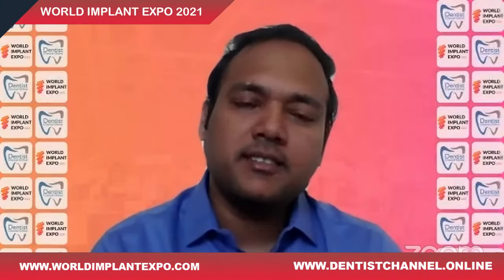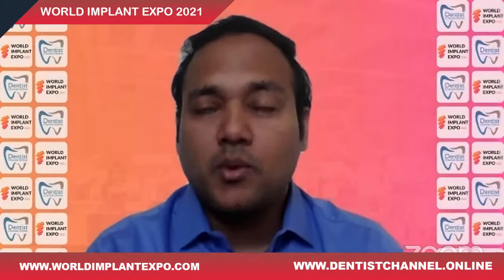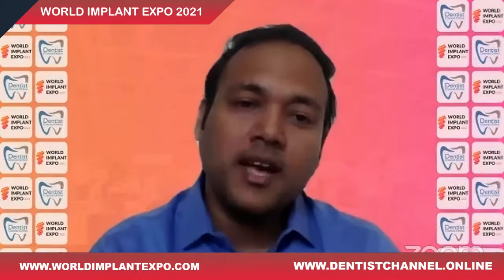If you're really confident in your implant placement, and really sure that you haven't breached the lingual cortical plates, yes, you can avoid taking the CBCT. Otherwise, if you think some defect has been created, then it's better you go in for a CBCT.